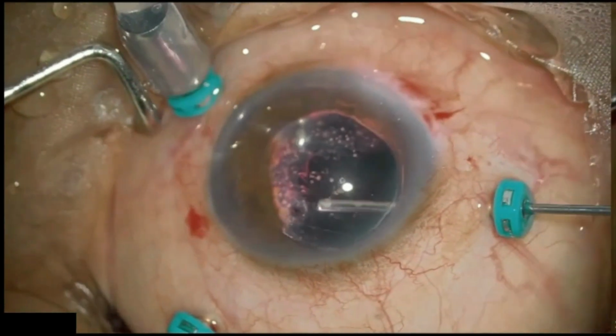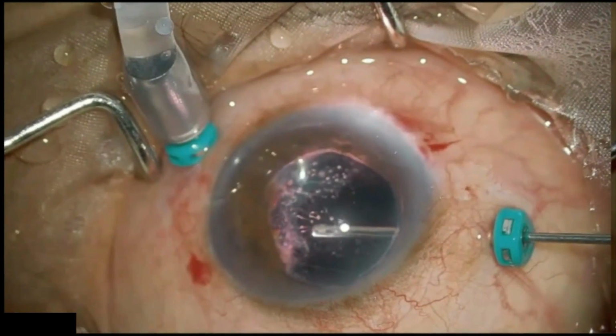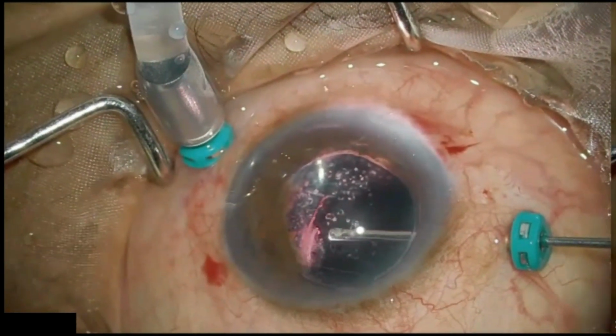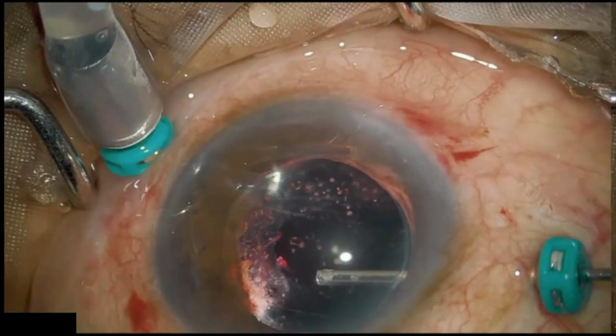But even that can be surprising, as we see in this case, the neovascularization has progressed over the posterior capsule and we can see blood oozing from the posterior capsule after PCtomy, and we had to cauterize it.